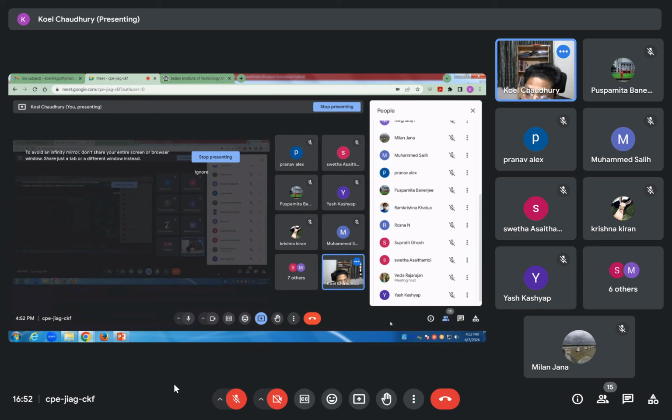So if I'm repeating my MR sequence 256 times to map 256 by 256 cells, how much increment do I have to give to the Y gradient? How many times? We'll have 256 different frequencies. So I have to give increment to the GY how many times? 256 times. Perfect. Is that clear to all of you?